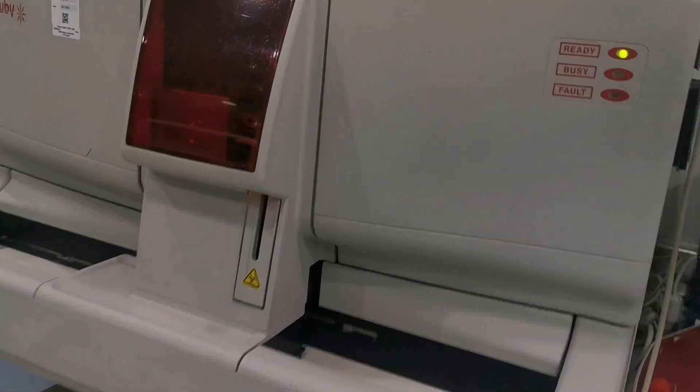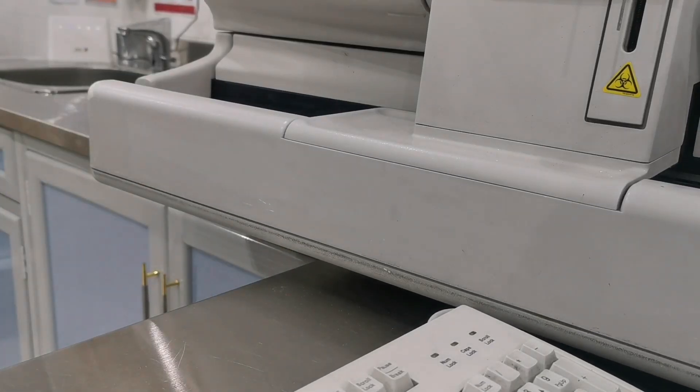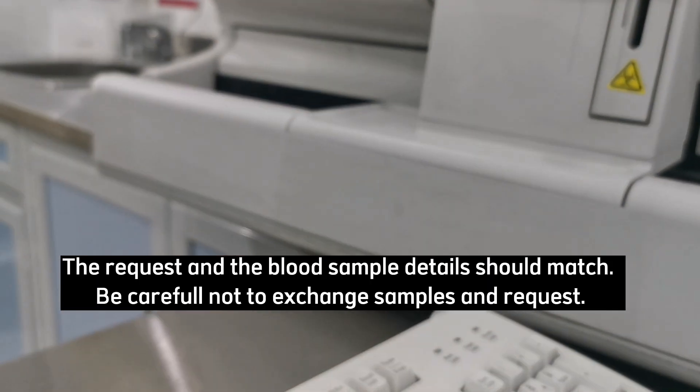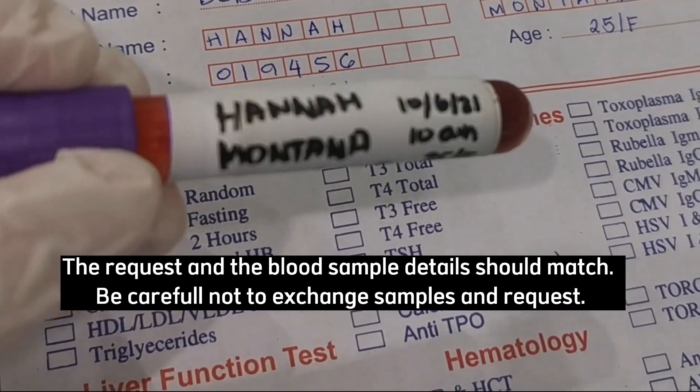This is the machine for CBC. First, check if the laboratory request and the blood sample have the same details. The request and the blood sample details should match. Be careful not to exchange samples and requests.